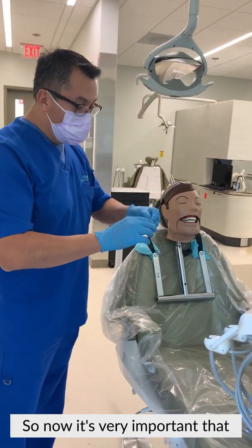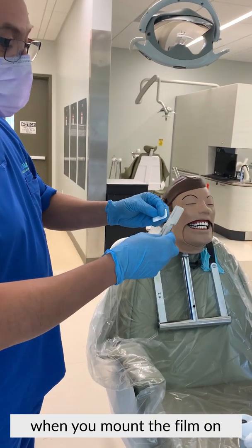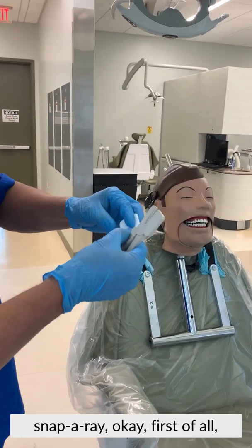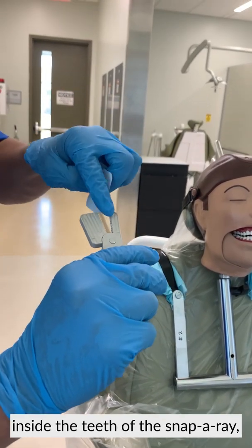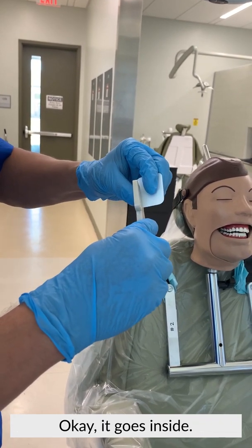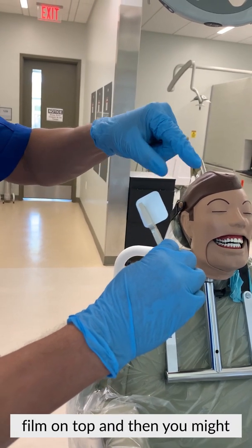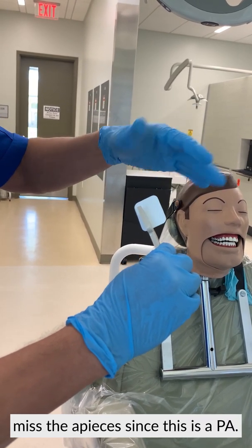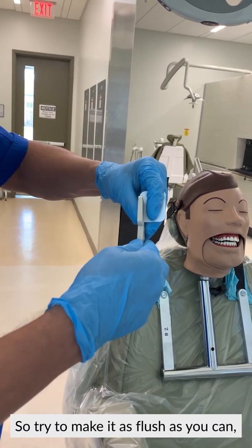So now it's very important that when you mount the film on the snap ray, first of all you have to look at the dot of the film. The dot has to be inside the teeth of the snap ray. Okay, it goes inside. Make sure it's not sticking out too much because you'll be wasting film on top and then you might miss the apices since it's a PA. So try to make it as flush as you can.